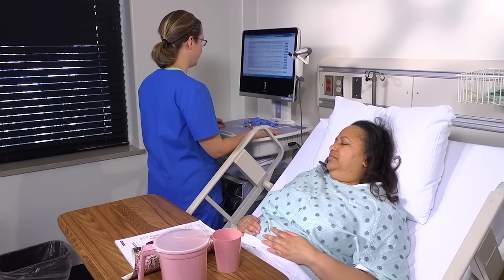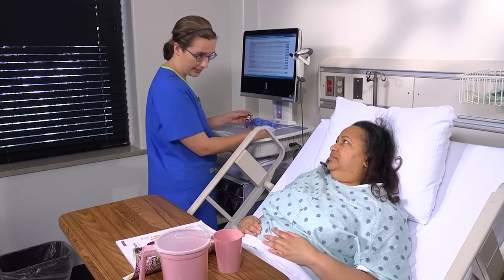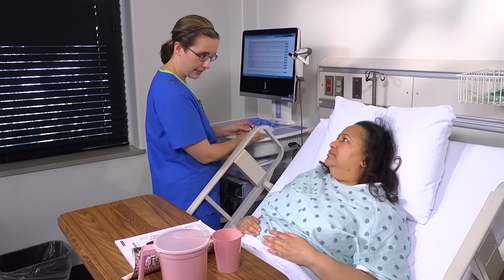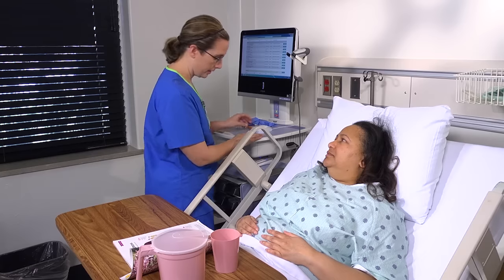At the bedside, once again compare the medication label with the MAR. This is your third check. Tell the patient why she's getting the medication, what it does, and what its potential side effects are. Encourage her to ask questions.